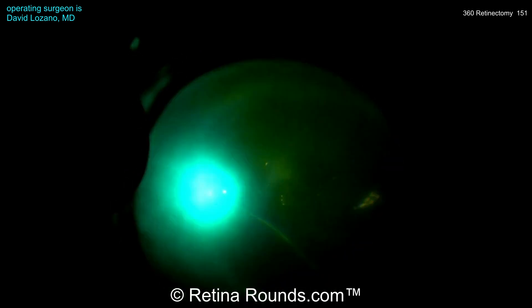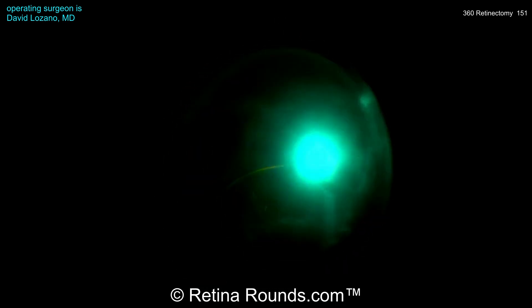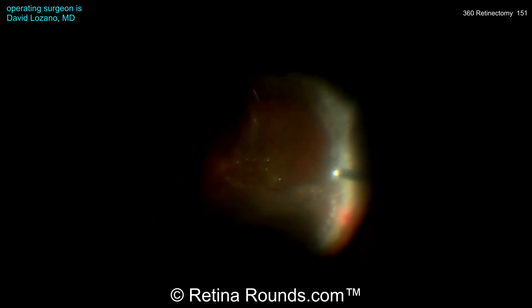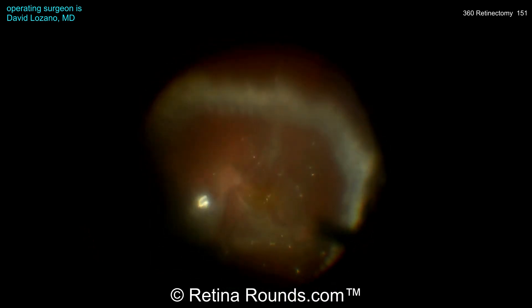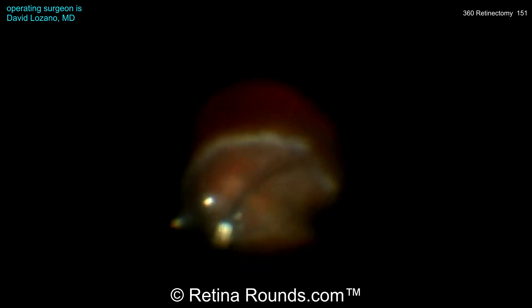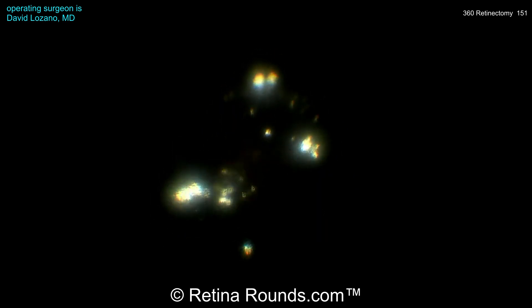Once the retinectomy is done, perfluorocarbon liquid is used to completely flatten the retina, and now Dr. Lozano is applying laser. The laser around a retinectomy edge should be about three rows of near-confluent laser. You do have to be careful, especially with the diathermized edge, that you don't mistake the whitening of the diathermy for whitening of laser. Make sure that spots are performed in three rows to near-confluent spots. An air-fluid exchange is then performed and silicone oil is instilled as a tamponade agent.